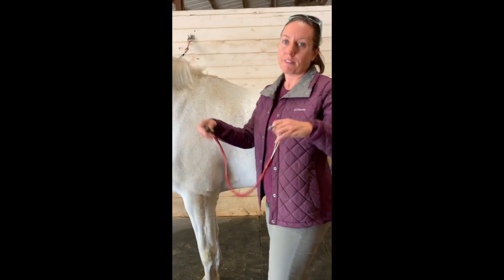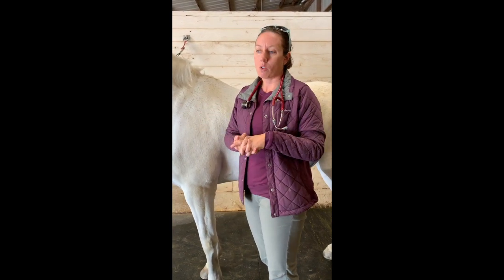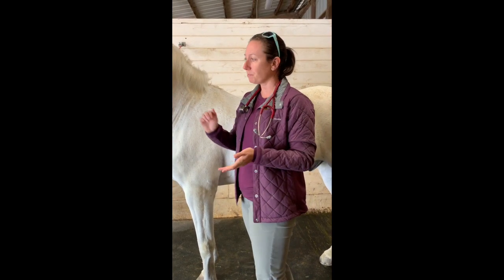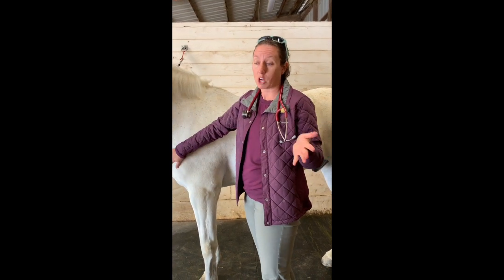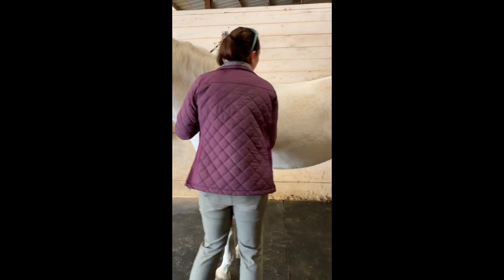I like to listen for 15 seconds and then multiply by four to get my heart rate per minute. Normal for horses is between 26 and 44 beats per minute, and that will change if they just got exercised or are feeling sick. You should know what your horse's normal is.